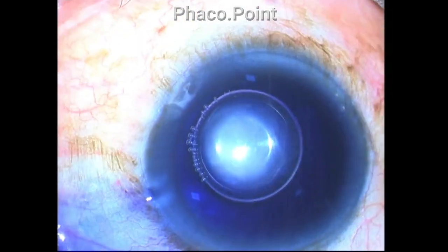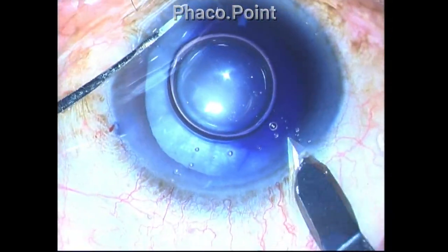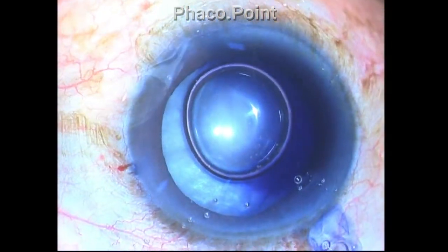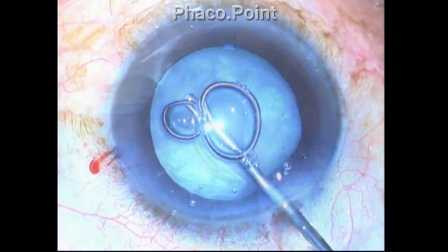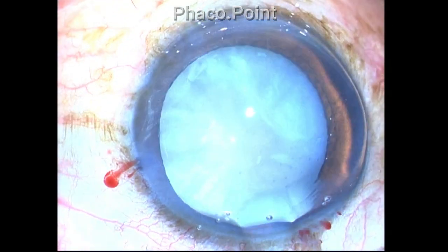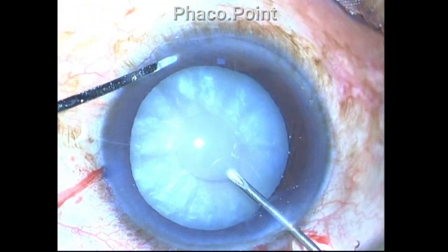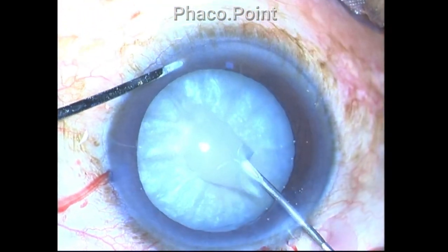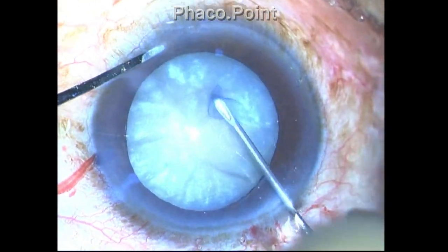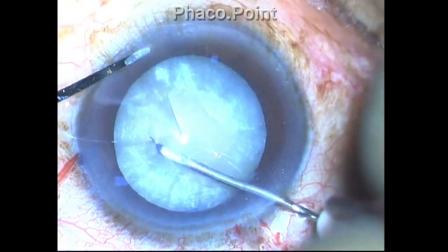The beginning of the case was pretty uneventful. It started with staining the anterior capsule with trypan blue dye and a carefully constructed clear corneal incision. The capsulorhexis was then performed with a 26 gauge cystotome. And even though I encountered liquefied cortex, I found I could still perform the capsulorhexis with a gentle posterior pressure and traction.